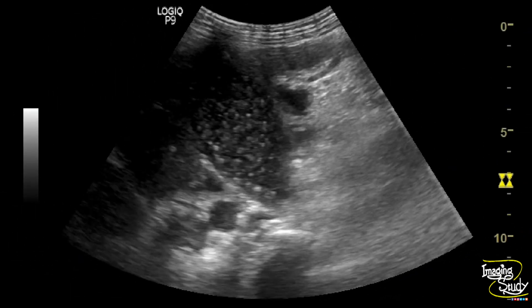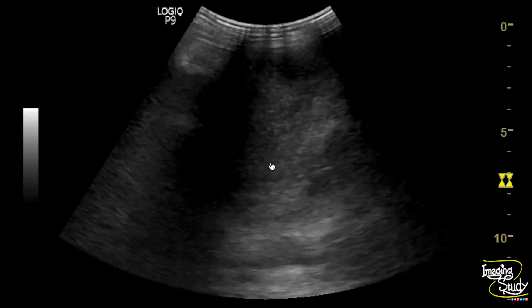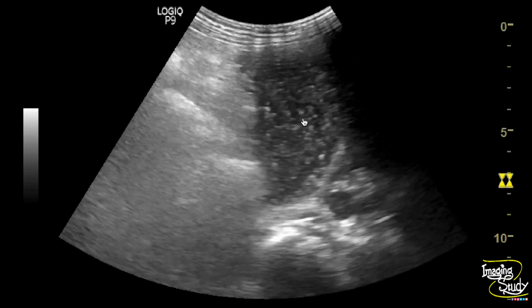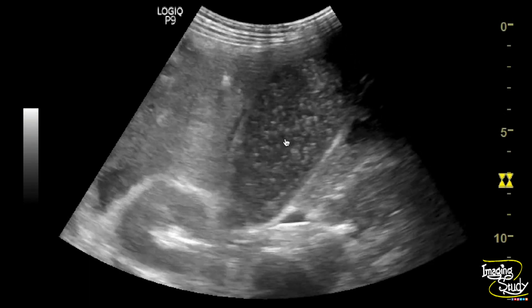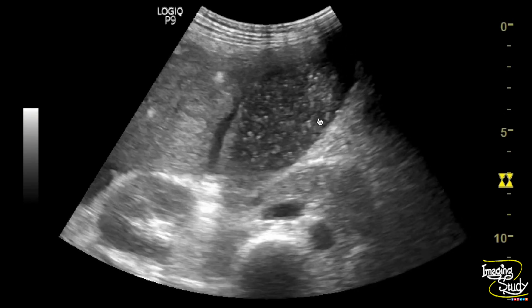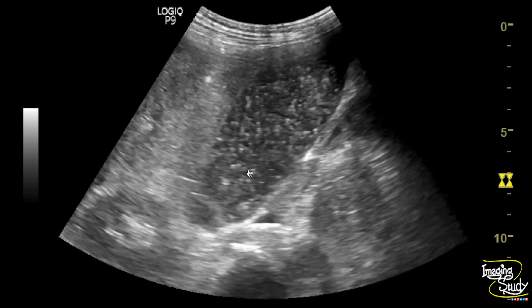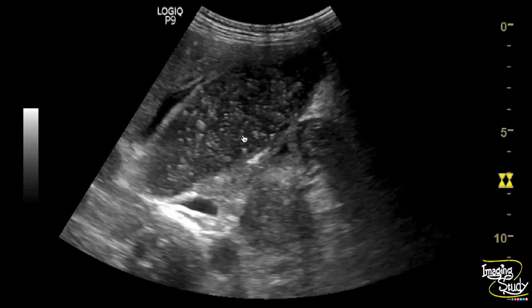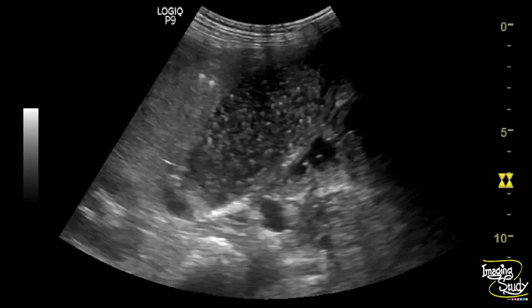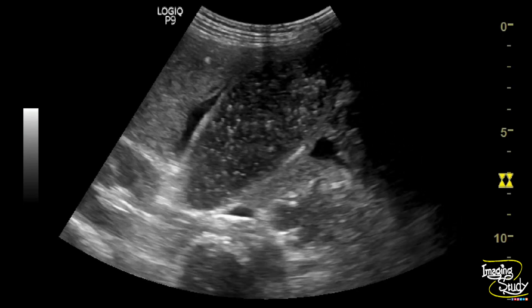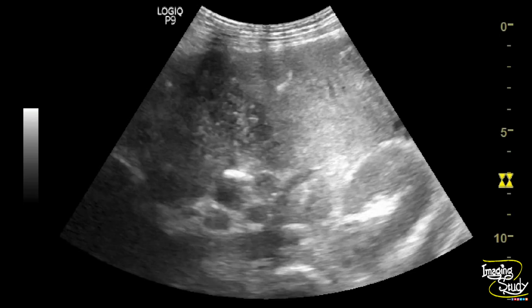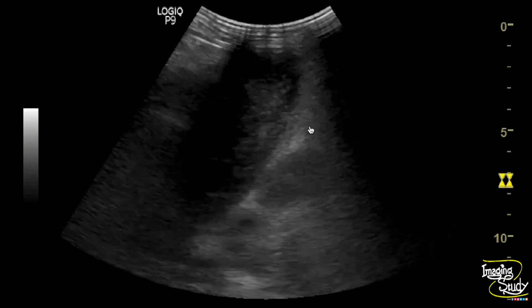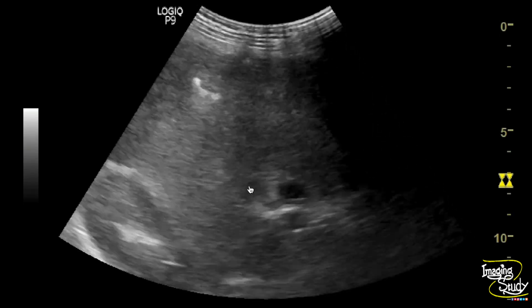Here is the view of the gallbladder. You can see diffuse sub-millimeter echogenic foci casting comet-tail artifacts within the gallbladder lumen. These are called cholesterol flotillas or microlithiasis. You can also see some ascitic fluid collection adjacent to the gallbladder.